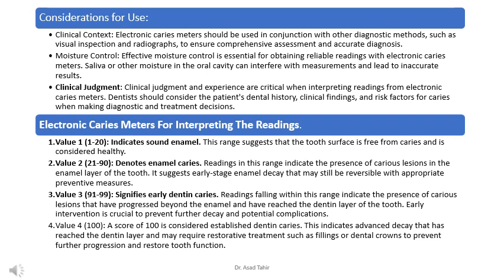Clinical judgment. Clinical judgment and experience are critical when interpreting readings from electronic caries meters. Dentists should consider the patient's dental history, clinical findings, and risk factors for caries when making diagnostic and treatment decisions. Electronic caries meters: interpreting the readings.